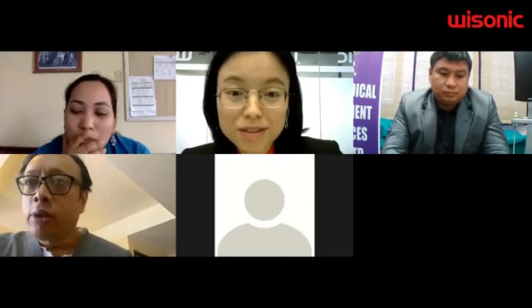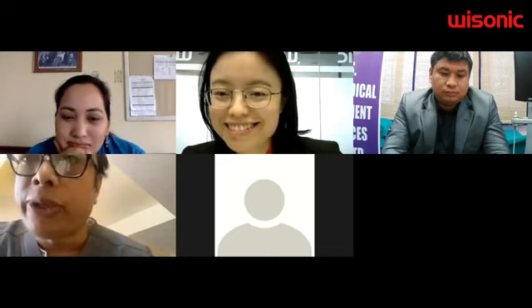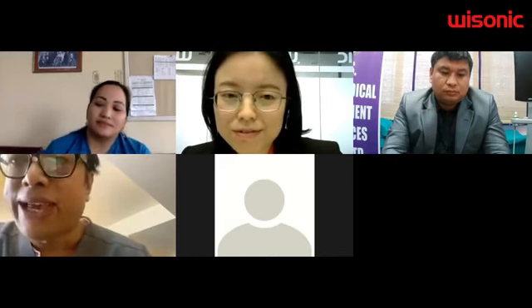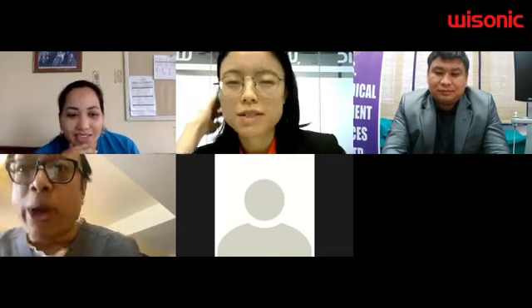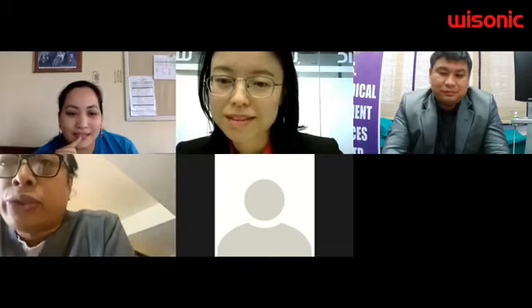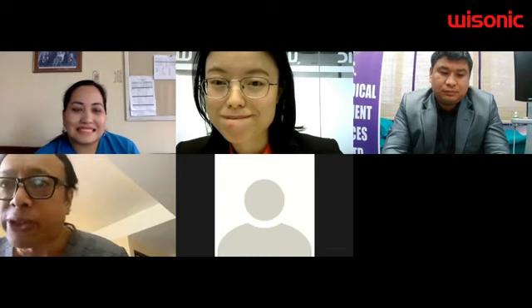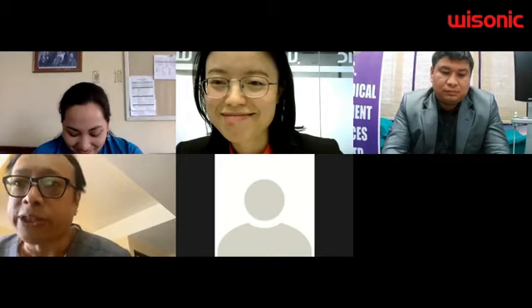Any more questions? Okay, there is no... Dr. Shrish, you can check in the Q&A box. There are no new questions in the comment box right now. Actually, I cannot see any question right now because I was logged out. Okay, he was locked out, right. So one question is there. So do you think 5% dextrose or triamcinolone would be more effective for carpal tunnel syndrome? Lee Chong has asked whether 5% dextrose or steroid triamcinolone will be more effective for carpal tunnel syndrome. Okay, thank you very much for that question, actually.